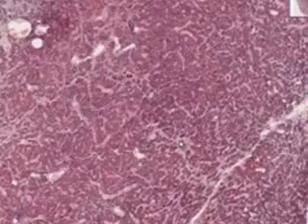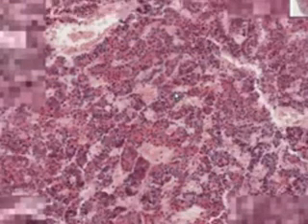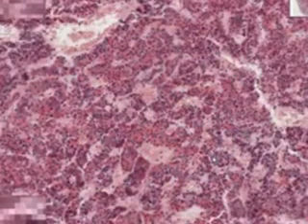The basophils, I think I could probably find a good little differentiation right here. Here we go. These bluer basophilic looking cells, which you see here, a little bit here, and they're really kind of interspersed with the red cells.